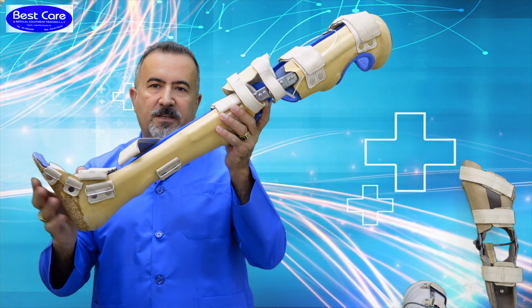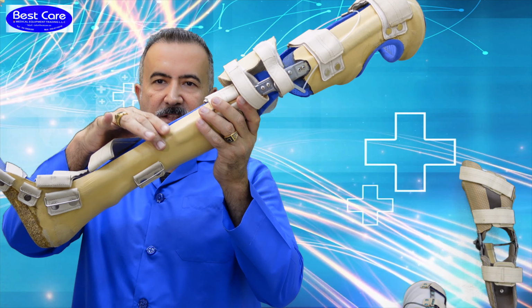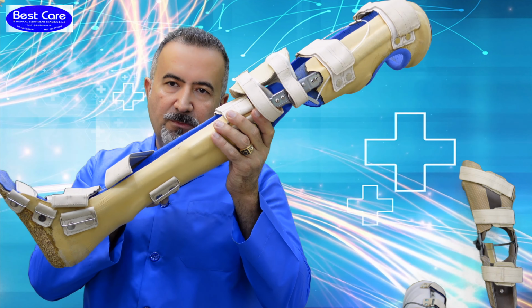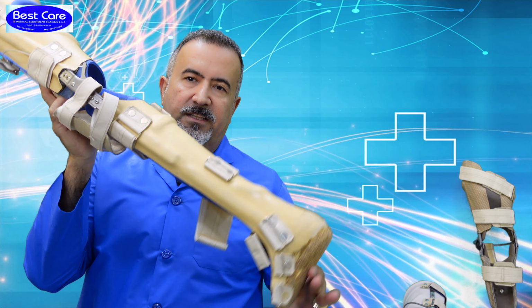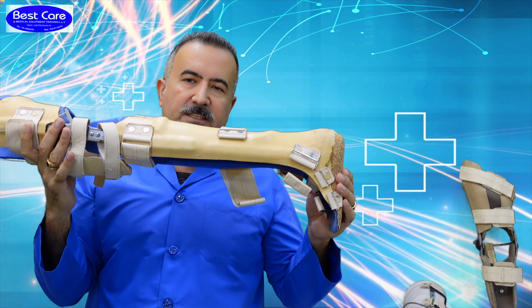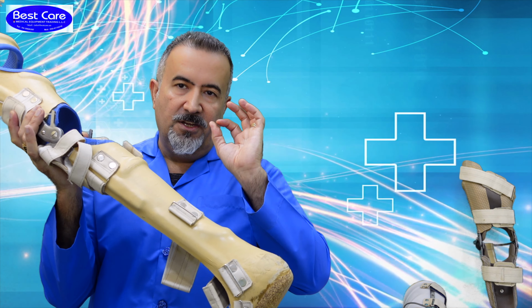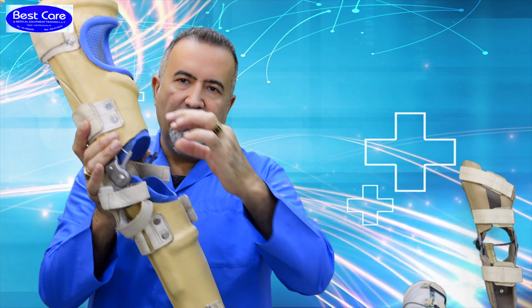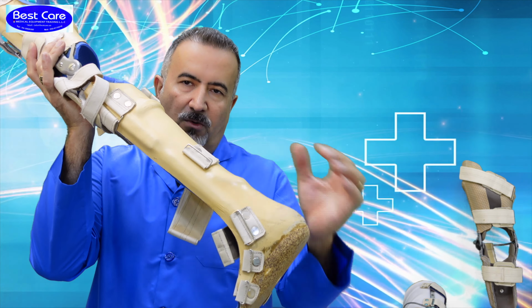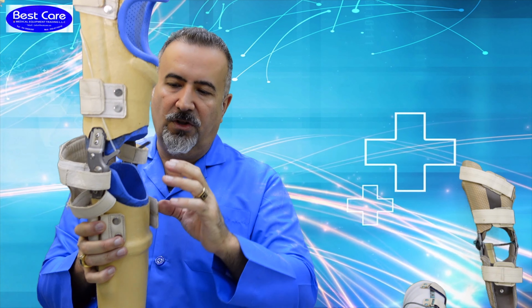The difference between this and the two previous ones, you can see it's made from lamination carbon fiber. In all of them, the material that we have used is lamination and carbon fiber and not flexible lamination. What does it mean? Above and below parts are very rigid and very strong, made from one type of lamination only.